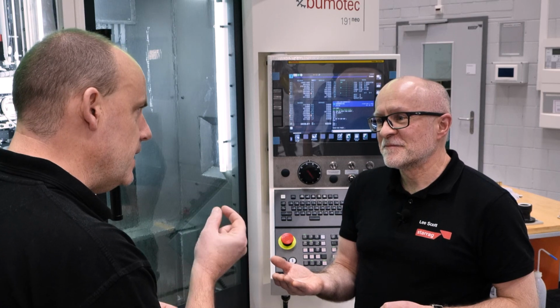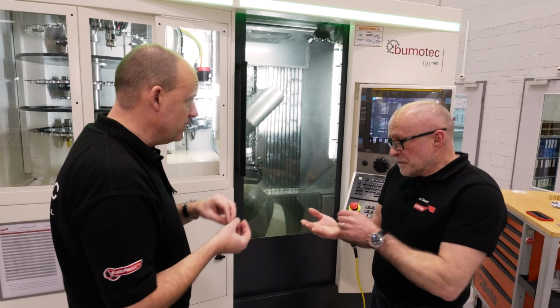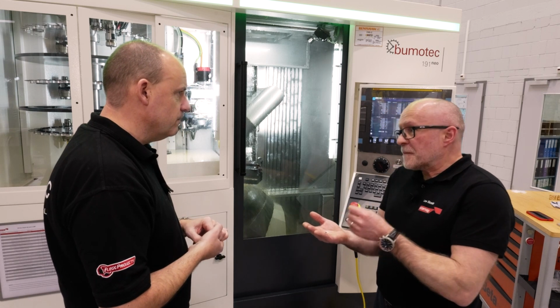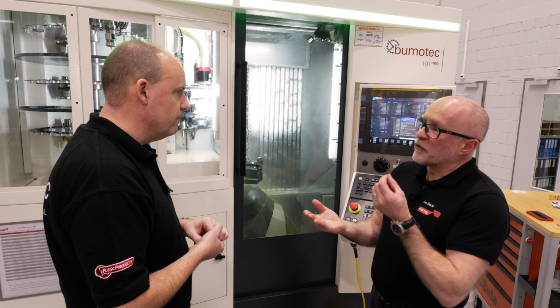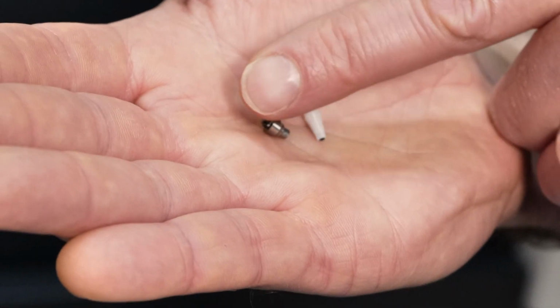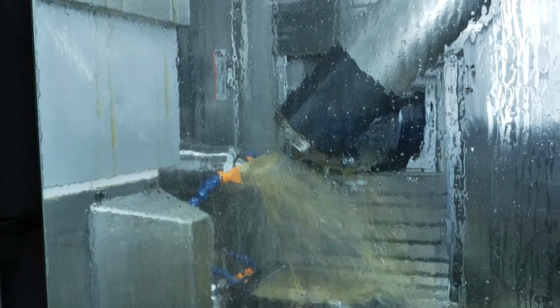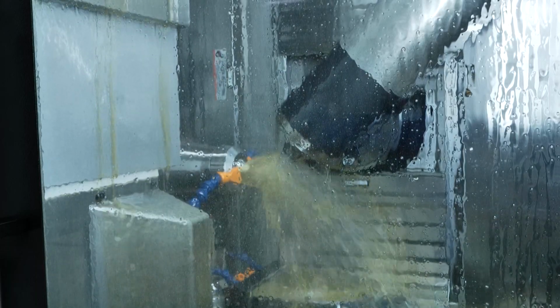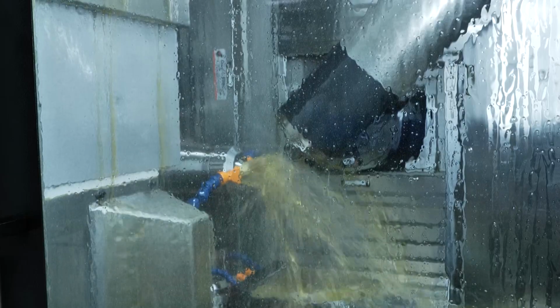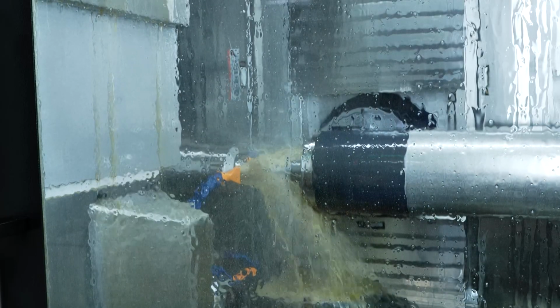And they're very small. I mean, the seal between these is really important. If the assembly isn't fully sealed, you get bacteria. If you get bacteria, then the body rejects the assembly. So the critical thing with these is the seal between the implant and the abutment and the ceramic, so that there's a perfect fit.